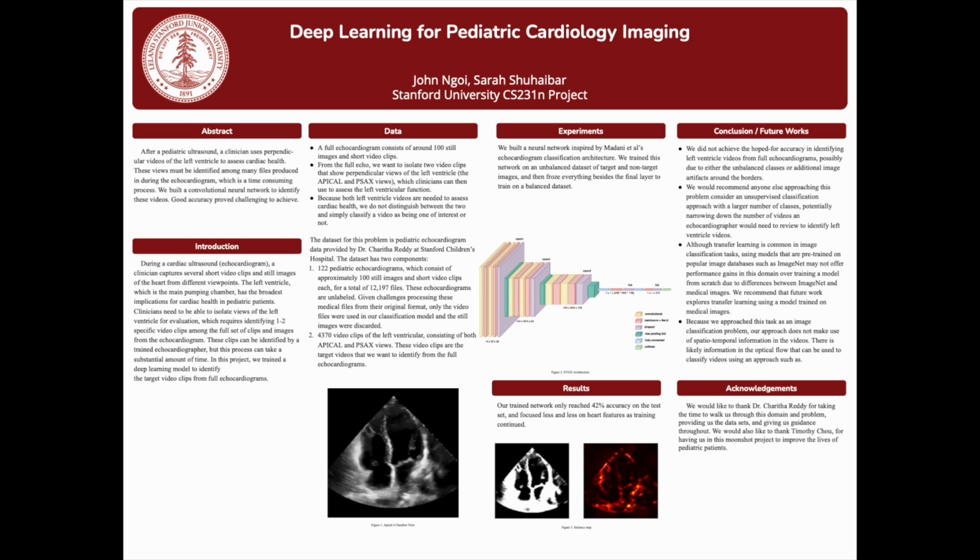During a cardiac ultrasound, a clinician captures several short video clips and still images of the heart from different viewpoints. The left ventricle, which is the main pumping chamber, has the broadest implication for cardiac health in pediatric patients. Clinicians need to be able to isolate views of the left ventricle for evaluation, which requires identifying 1 to 2 specific video clips among the full set of video clips and images from the echocardiogram. These views can be identified by a trained echocardiographer, but this process can take a substantial amount of time.